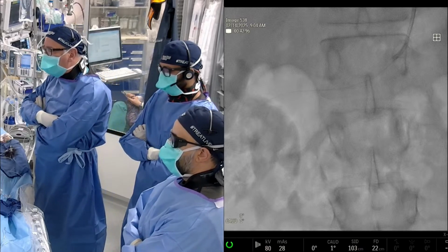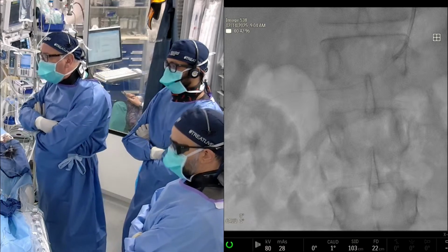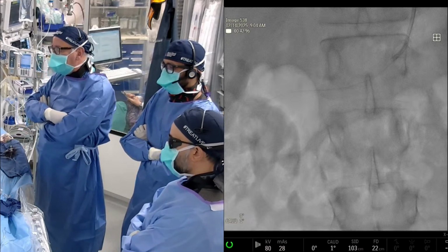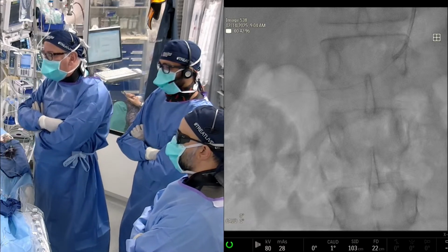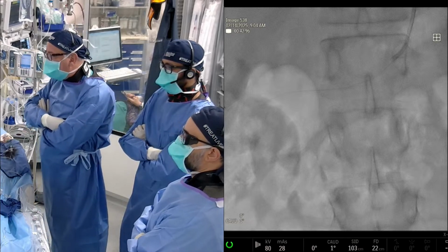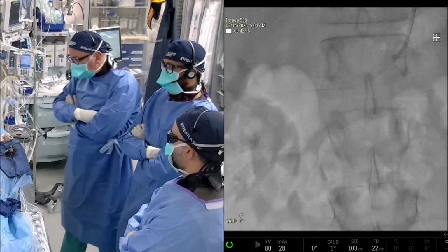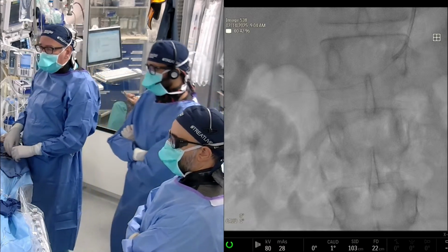Our workhorse wire for these kinds of cases is a 014 coronary wire. It's called Stabilizer, distributed by Cordis currently, and it's a very soft atraumatic tip with a very short transition. I think it's a very, very safe wire to do renal and visceral work on. So if we could go live to the IVUS, I think that would be great.